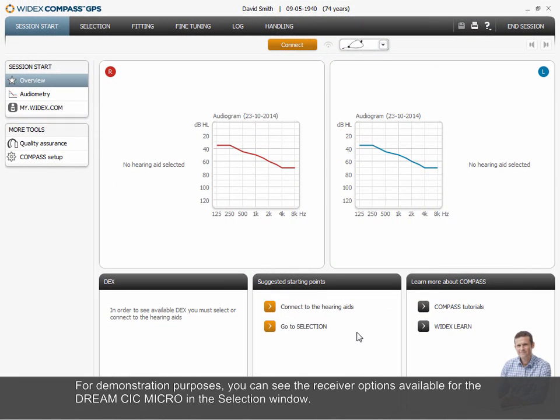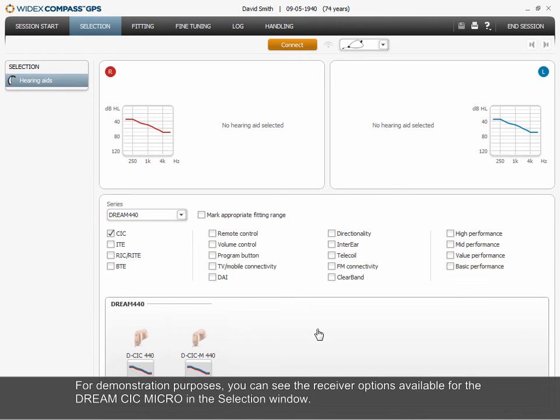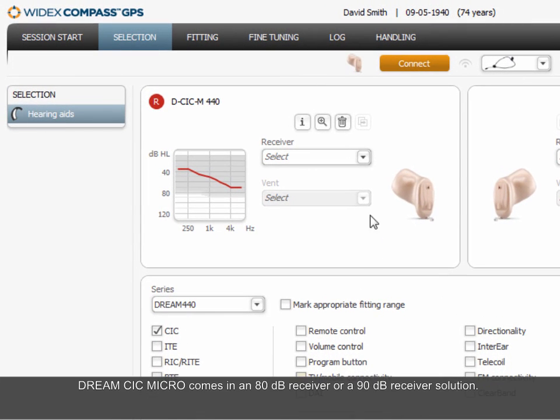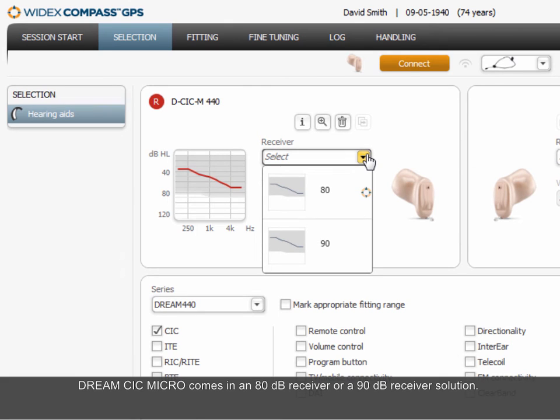For demonstration purposes, you can see the receiver options available for the Dream CIC Micro in the selection window. Dream CIC Micro comes in an 80 dB receiver or a 90 dB receiver solution.